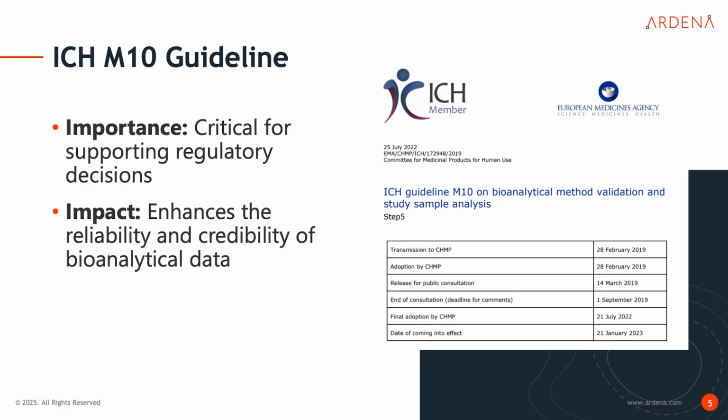The purpose is harmonized expectations across regulatory agencies like the FDA, EMA, PMDA and ANVISA, reducing duplication of effort and improving the quality of submissions. So whether you are validating a new method or analyzing clinical samples, ICH M10 is your blueprint for doing it right.